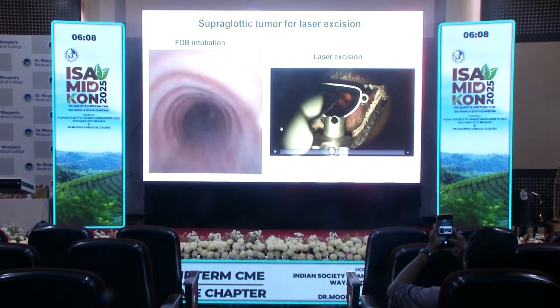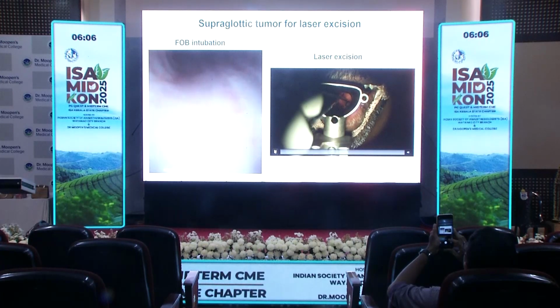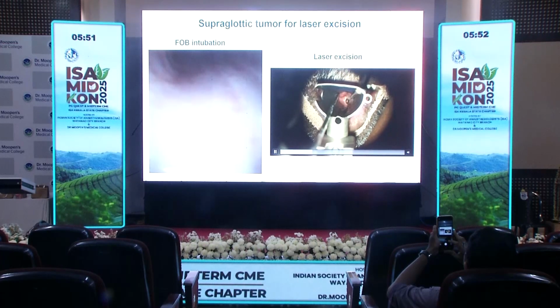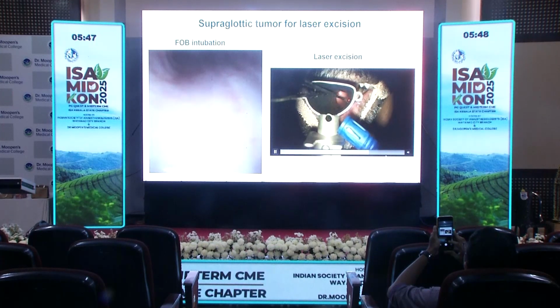In the second video, actually it's a procedure. You can see the laser being used to excise the supraglottic lesion. Here the tube was retained and surgery was done. Okay, you can just see the steps of the laser resection.